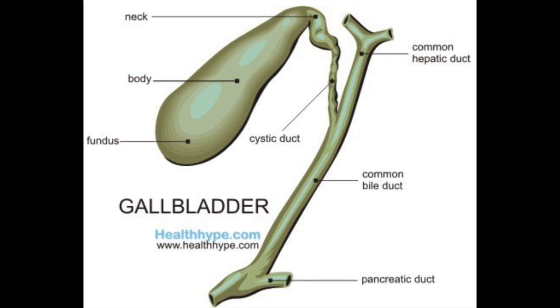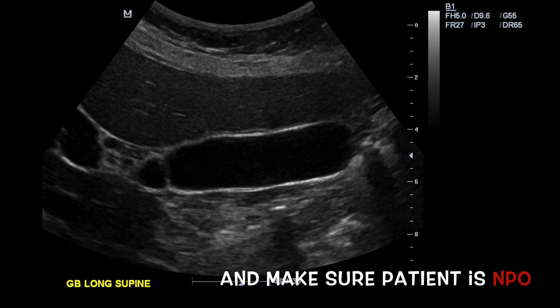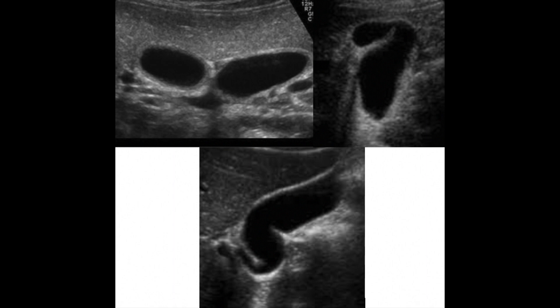The first thing we do in any scan before taking even your first picture is to survey whatever we're looking at — meaning we find the gallbladder and sweep all the way out left, all the way out right, then turn transverse and look superior to inferior. We do this to look for any major pathology, stones, sludge, or abnormalities we want to make sure we go back and take pictures of. Some people have really interesting shaped gallbladders — I have what's called a Phrygian cap. That's what the survey is for: to give ourselves an idea of exactly what this scan is going to look like.